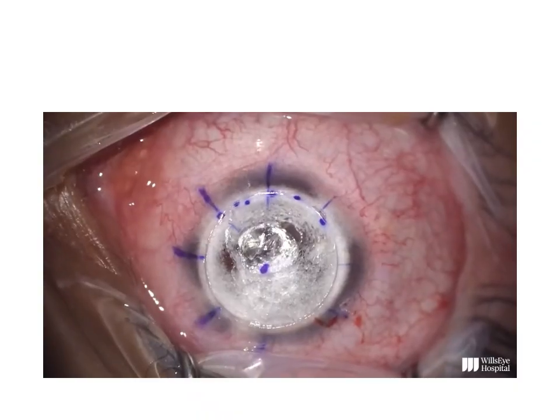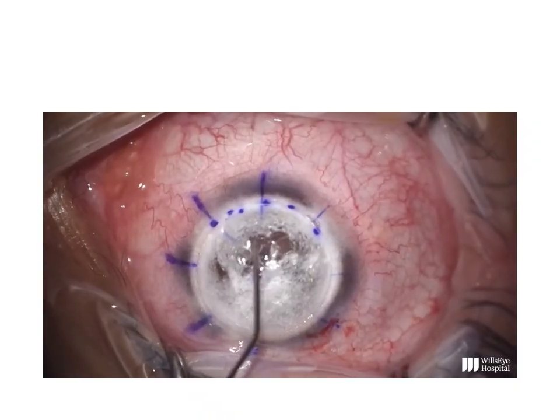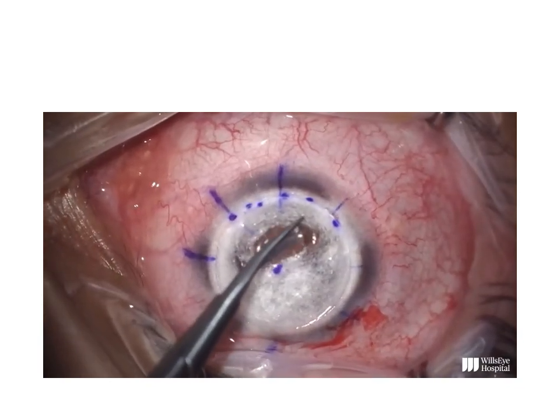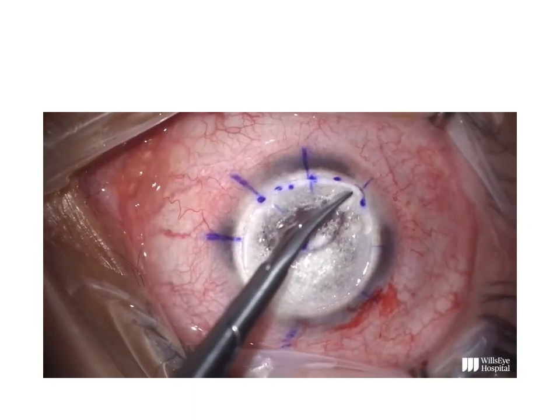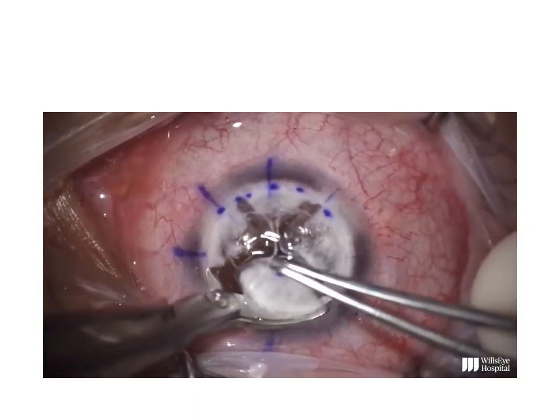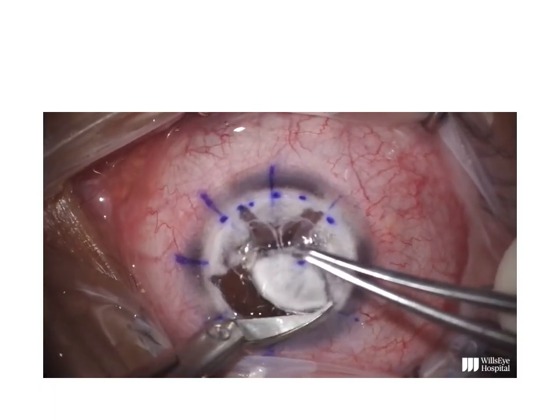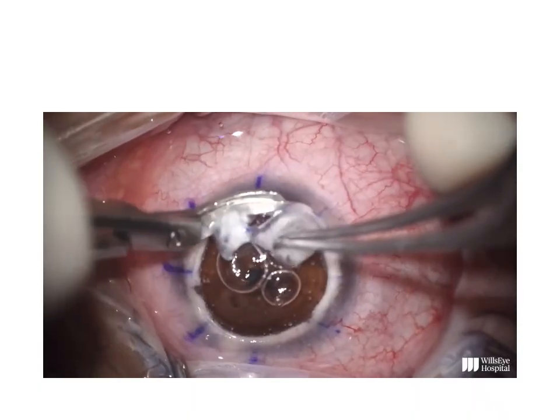That is the cut in the stroma. The air is released. Visco is injected in the plane between the stroma and the predescemet. That's the blunt corneal scissors. Why blunt? Because you don't want to damage the underlying Descemet membrane. Blunt corneal scissors being used to remove the stroma in 4 quadrants, or the divide and conquer technique.